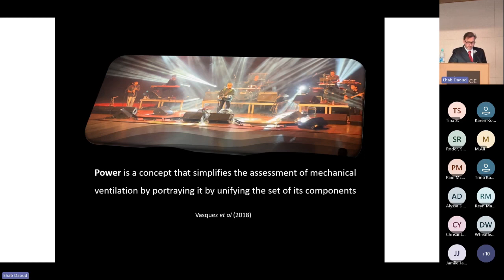Power is a concept that simplifies the assessment of mechanical ventilation by unifying its components. Based on this reasoning, the effects of components should not be considered separately, but by the effect of the set.